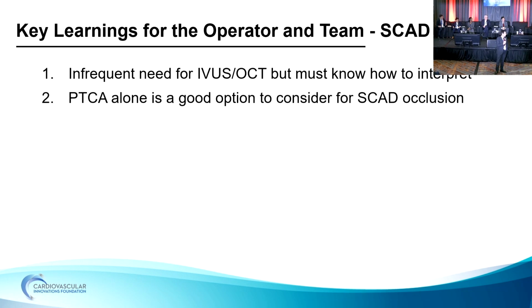We published a small series of STAR for SCAD, and the indication was exactly these cases. I had a case, not published, where the patient had a left main dissection. She was turned down for surgery. She was 39. And I did this case last year.